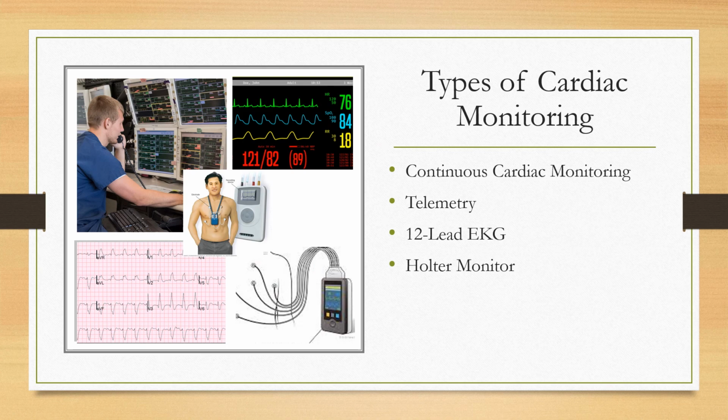So I mentioned this on the slide above. Continuous cardiac monitoring. Well, that's someone who's in bed. We have them set up with leads, and the leads are going to the monitor above them, and they're also going to the nursing station. So in the top left image there, you can see someone monitoring different patients and their rhythms. So that's continuous cardiac monitoring.